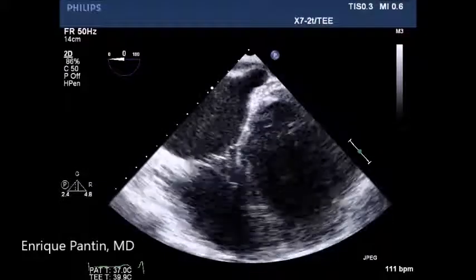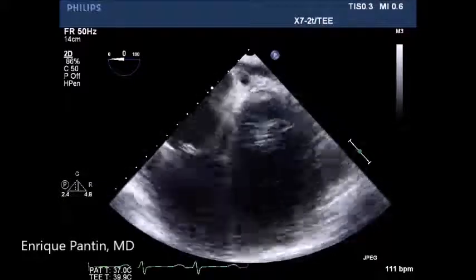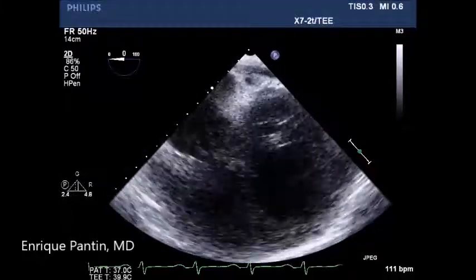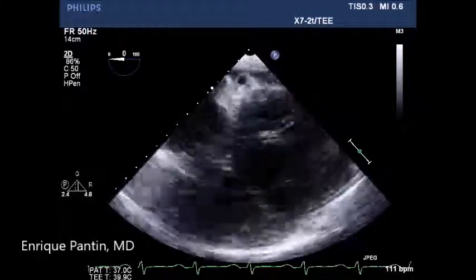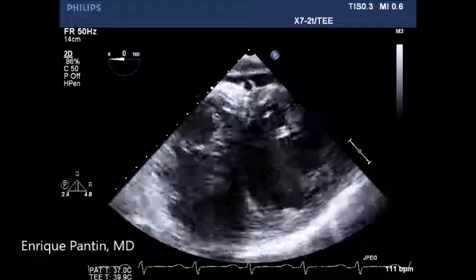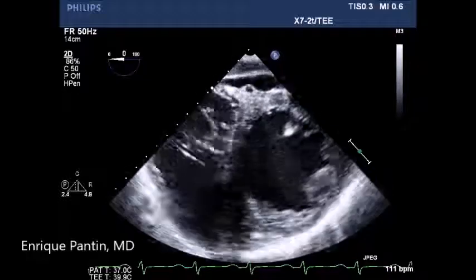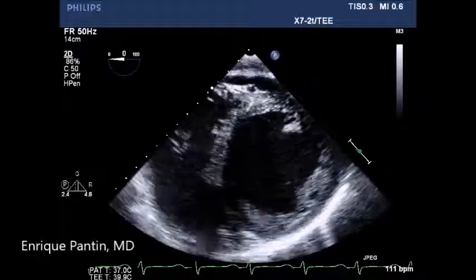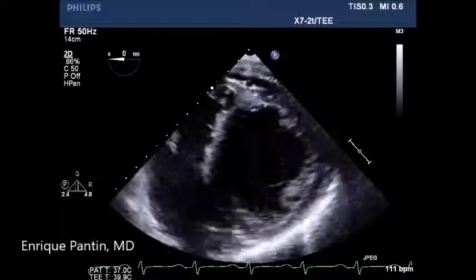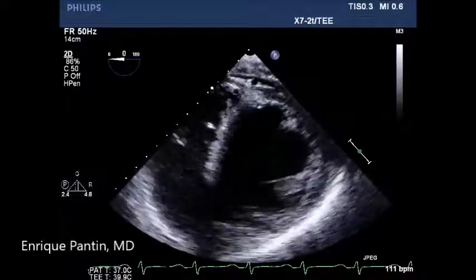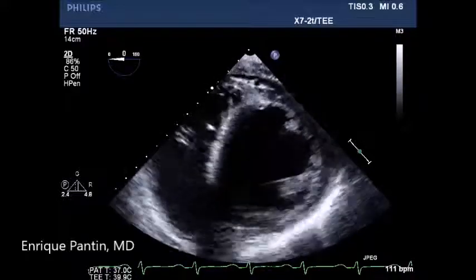We will do this again. We will follow the coronary sinus to the ostium of the middle cardiac vein and then advance the probe all the way into the stomach, into the distal middle cardiac vein.